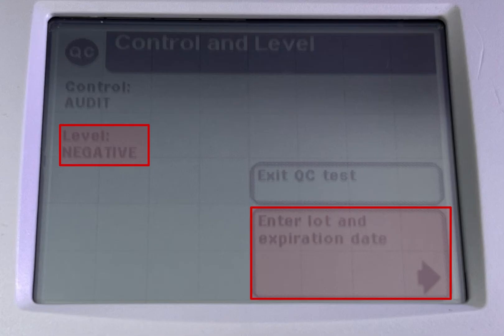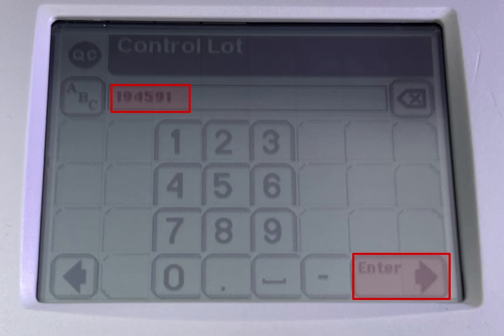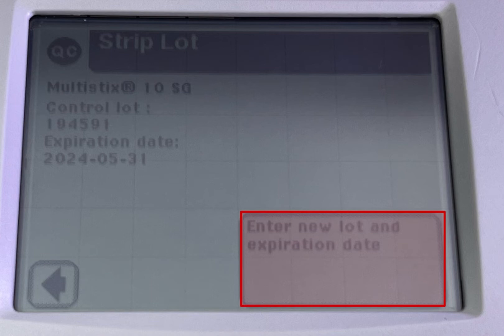Level negative. Click on enter lot and expiration date. Scan the negative QC control lot barcode on the card, then click enter. Add the expiration date and click enter.